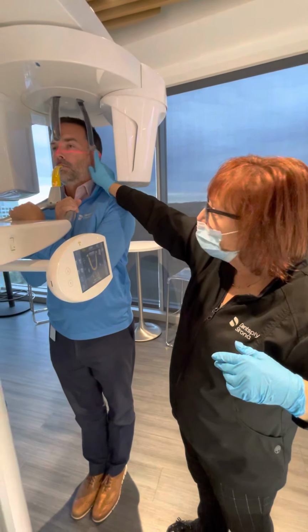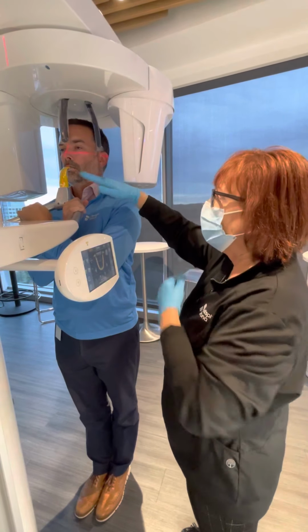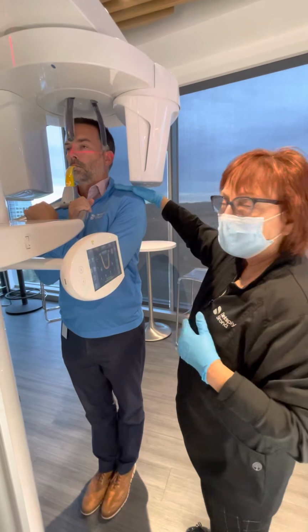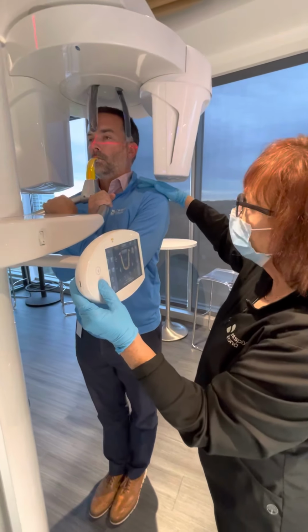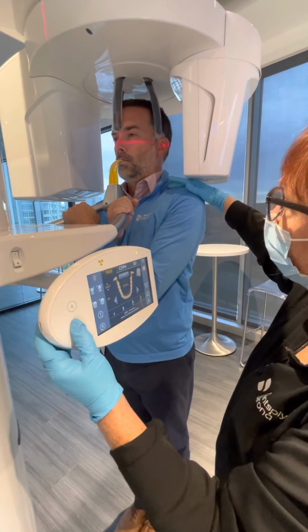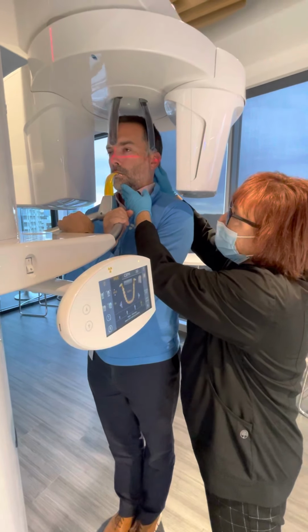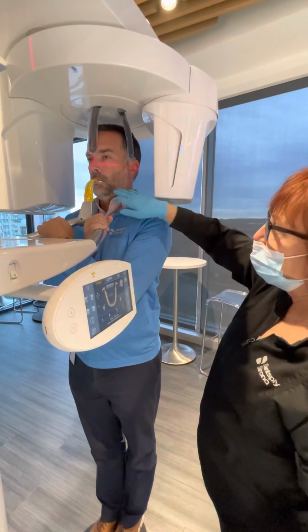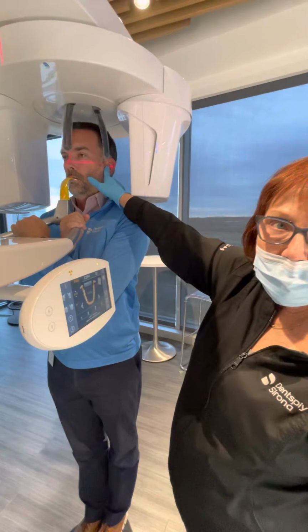So I need to lower the machine. So I'm going to tell the patient, I want you to let your chin drop with the machine, but do not drop your shoulders. And I usually place my hand on the patient's shoulder. I'm going to lower the machine. Sometimes if needed, and I know I didn't open, I'm going to stretch him up just to make sure. Now I have him down. So now I'm at the eye orbit to the top of the tragus.